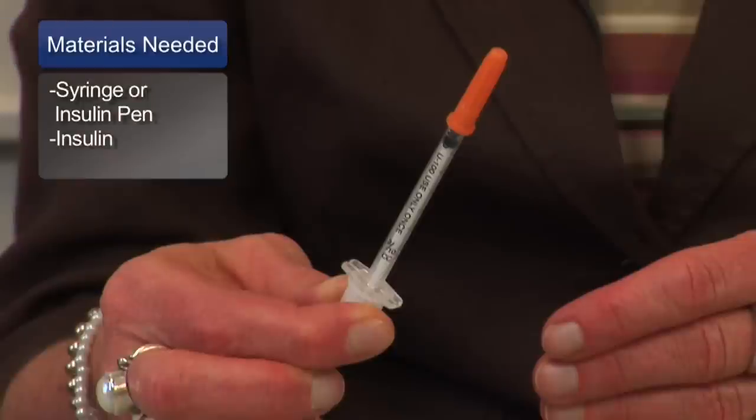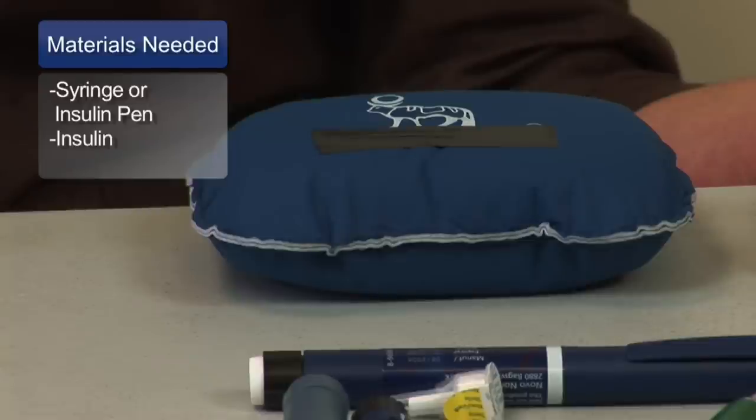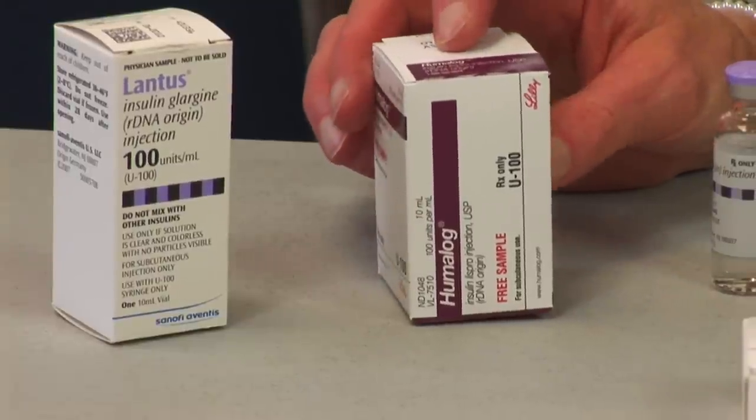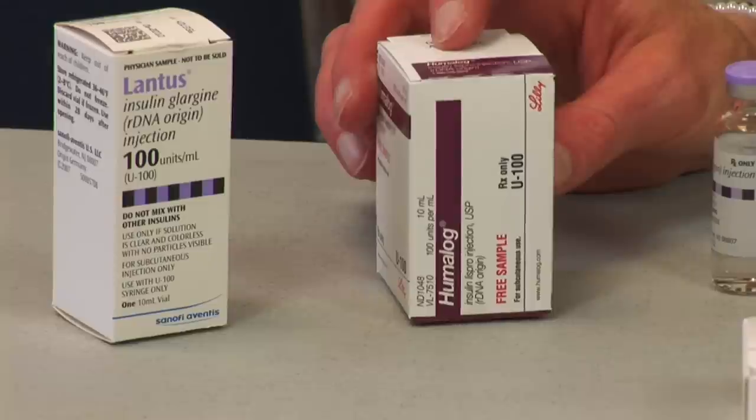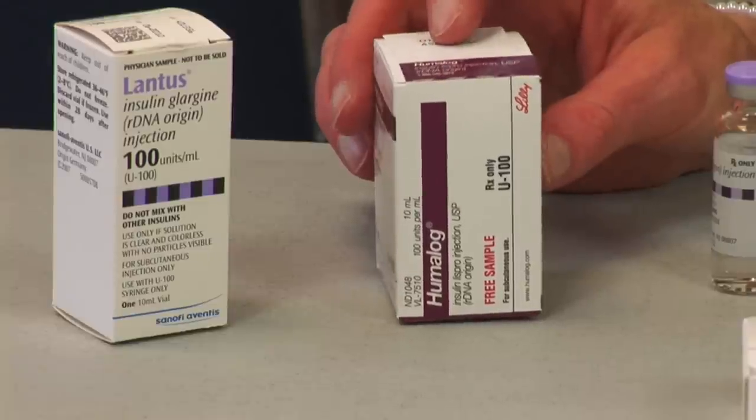I'm going to show you how to do an injection with insulin. We'd have an insulin syringe, a body where we're going to inject, and then some type of insulin. We have two kinds of insulin: a long-acting insulin that starts to work in 1 to 3 hours and lasts over a 24-hour period, and a rapid-acting insulin which starts to work in 10 to 15 minutes, peaks around an hour to an hour and a half, and is gone around 3 to 4 hours. Most people on insulin are going to have a combination of the two — once or twice a day with the long-acting, and then before each meal with the rapid-acting.